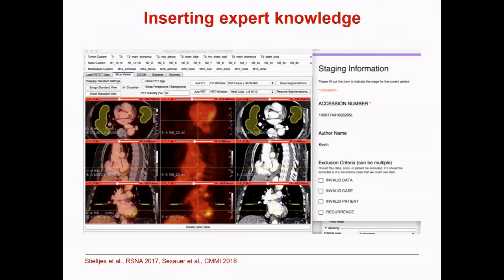That means if you have a tumor board situation, the person who's presenting this case has to read whatever the radiologist saw, and then in his head reconstruct what he thinks is the TNM. That takes a few minutes, and he can make mistakes. It's under pressure, and it's not his patient. Normally you don't present your own patients. There's one person that presents all the patients and hasn't seen that patient before. So what we said is, if we know what we want in the end, why don't we define everything? And that's what you see.